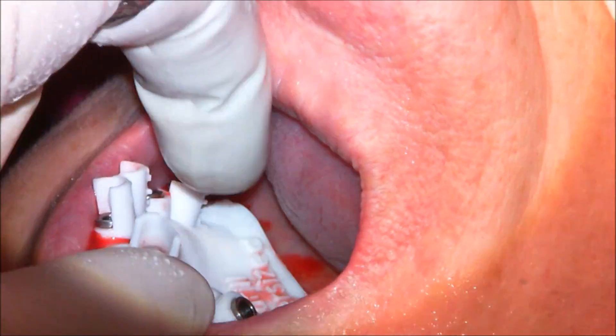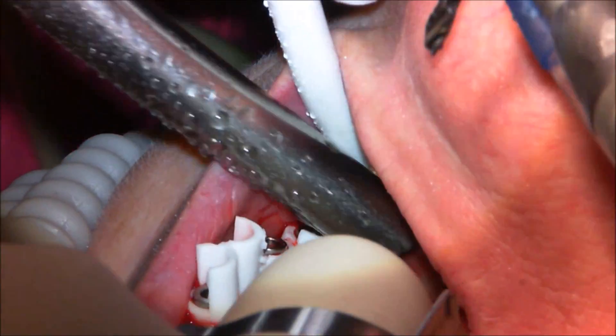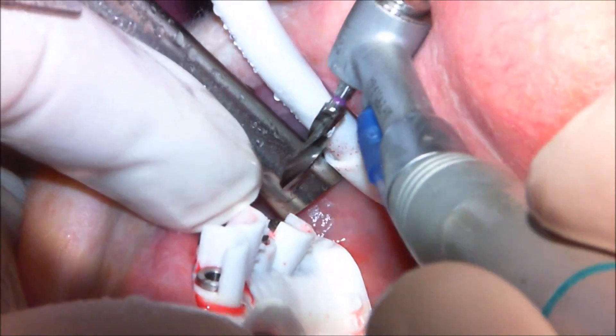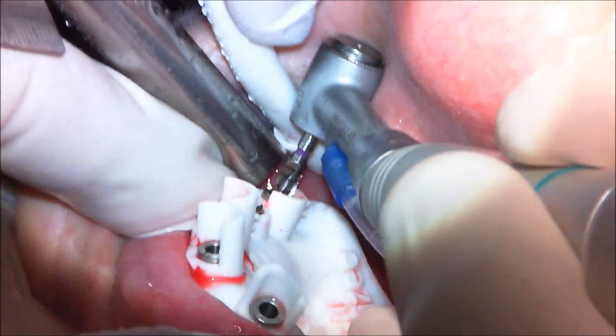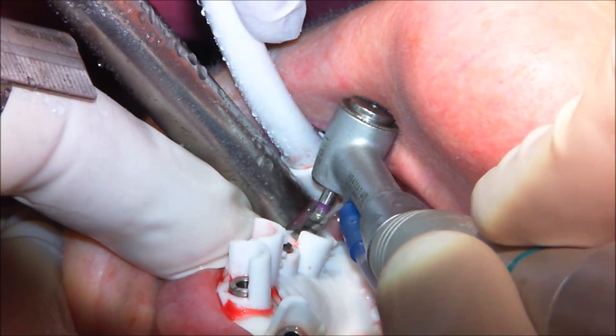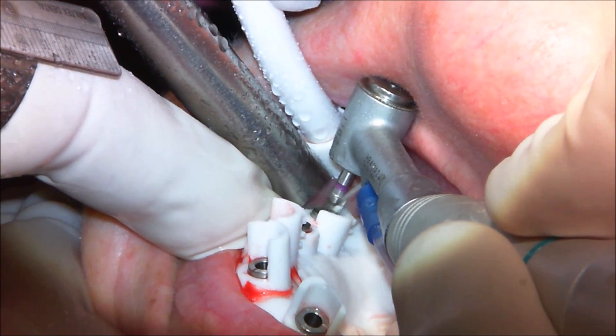You'll notice the guide tube came out a little bit. Some people worry when that happens, but it's no big deal. If you're really concerned, you can glue them in, but honestly it doesn't bother me. If a guide tube moves a little bit, you just push it back down — it doesn't affect the accuracy of the guide whatsoever.